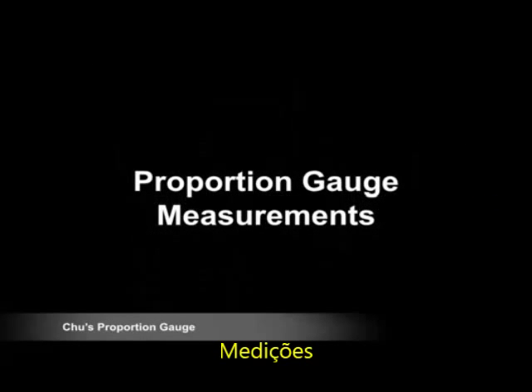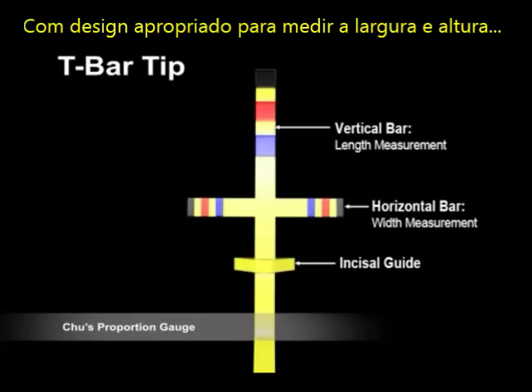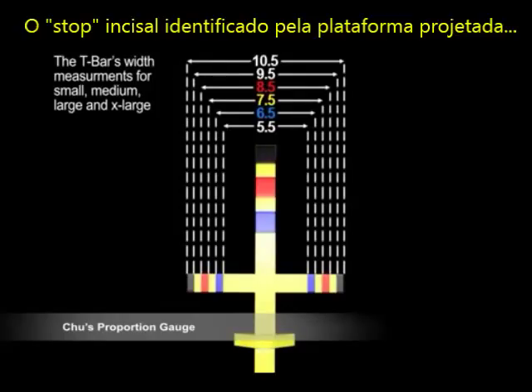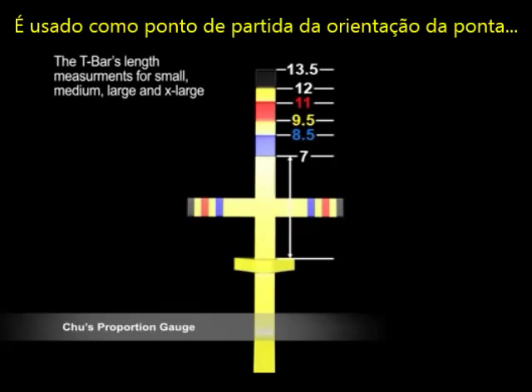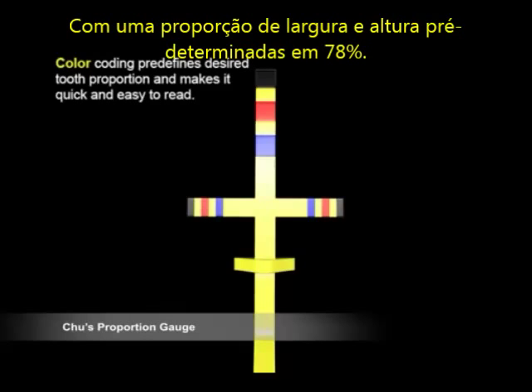Proportion gauge measurements. T-bar tip. Designed to measure the width and length dimensions and ratios of the maxillary anterior teeth simultaneously. The incisal stop, identified by the platform projection, is used as the starting point of tip orientation and measurement from the incisal edge position. The instrument is color-coded for easy visualization with a preset width and length ratio of 78%.